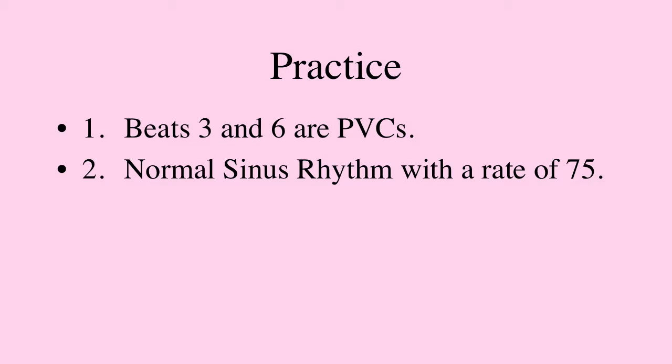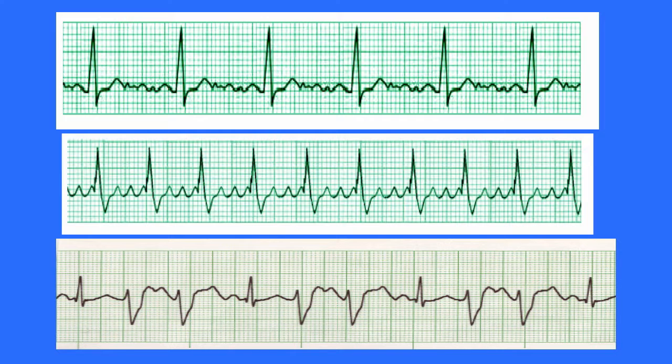On the next one, again, if you have tried these, that's a good thing to do, but I'll talk through them. On the next one, you have kind of a scratchy baseline at the top, and this is atrial fibrillation. The one below that has more of a defined baseline, and this is atrial flutter.